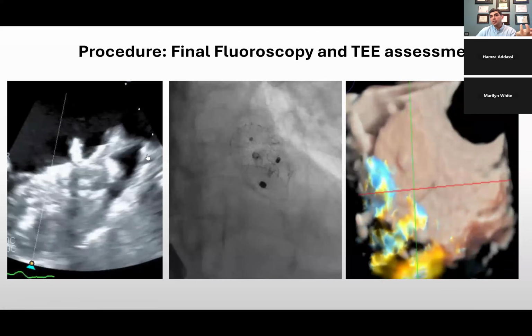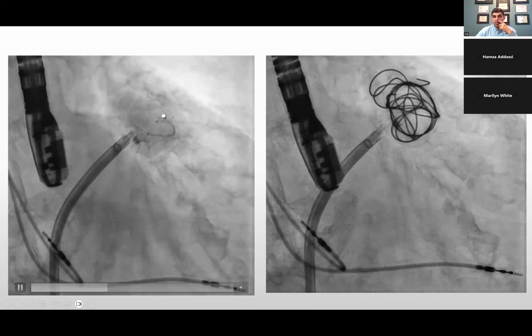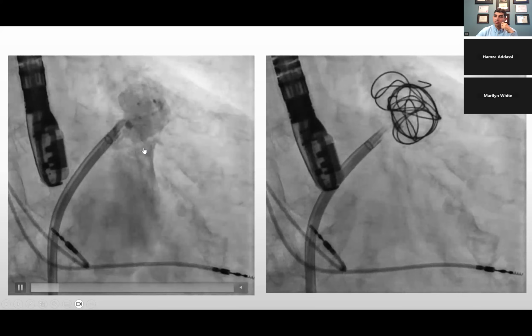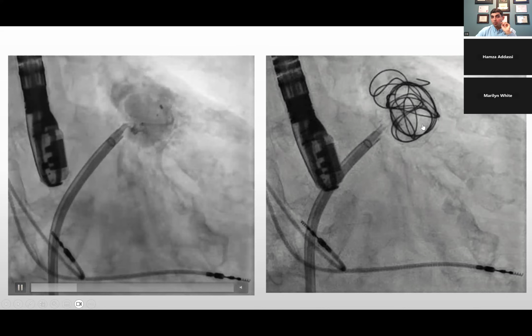What about if the size is not big? So this is another example. Another patient sent to me had a Watchman, but when you shoot contrast, you see it's not supposed to be like that, and there's a leak, so it's not walled off from clot. So in this case, what I did is I found the hole where the leak is happening, which takes a lot of patience, and then I delivered coils.